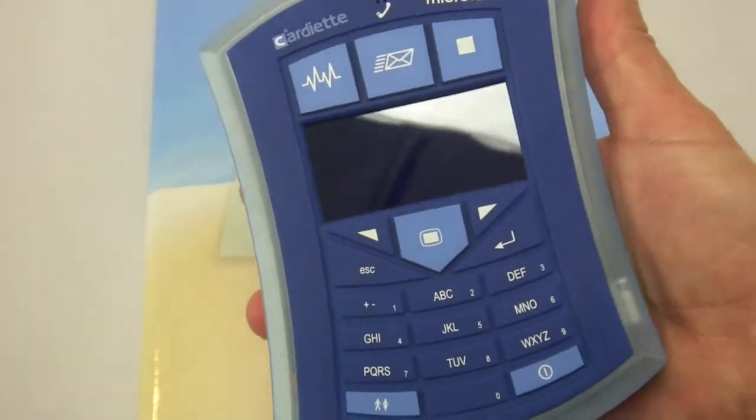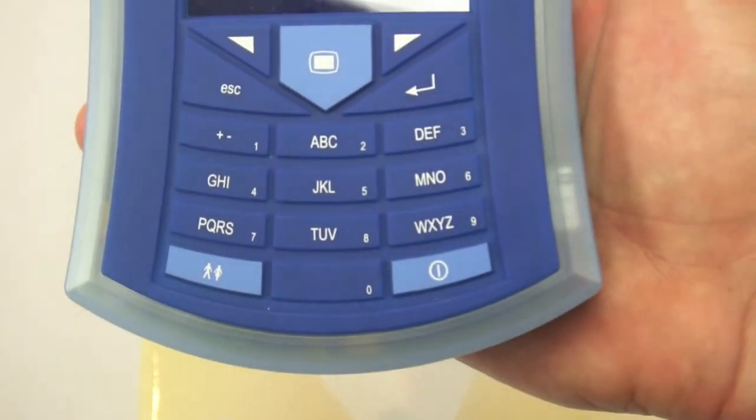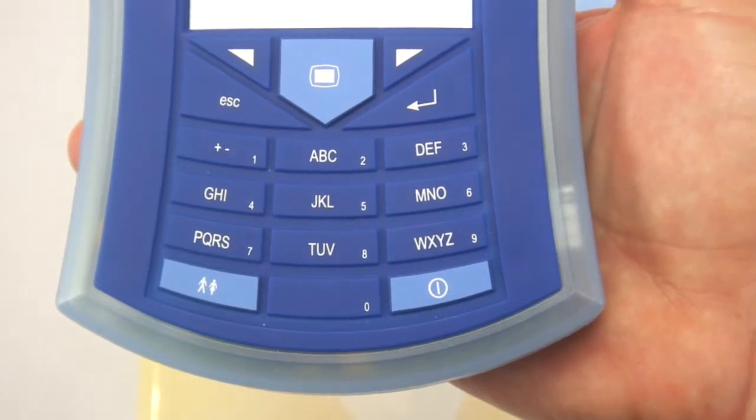You can see here the unit runs on four AA batteries. It is completely handheld or palm-held. It does have a cell phone-style keypad for entering patient data.